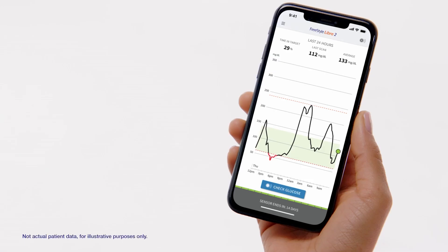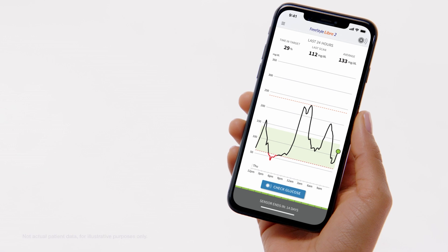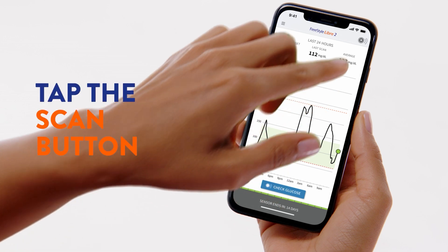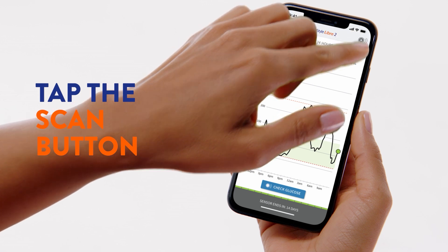If you're using an iPhone, there are two types of scan buttons: a blue button at the bottom of the home screen, and if present, you can also use the gray scan icon in the top right corner. Tap either scan button to put the app in a scan-ready state.